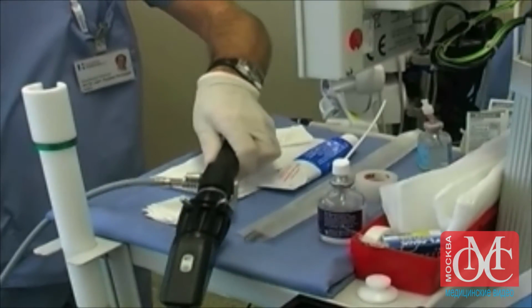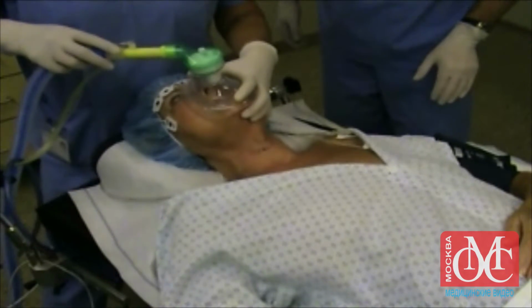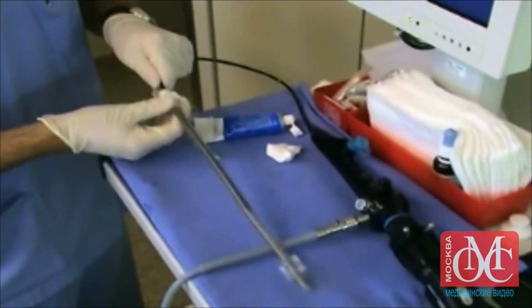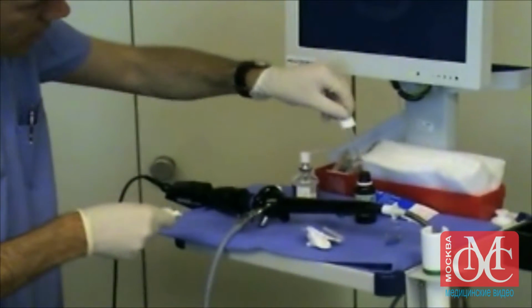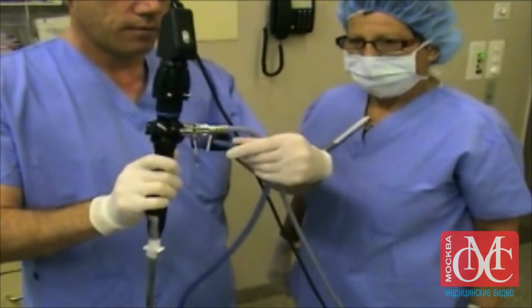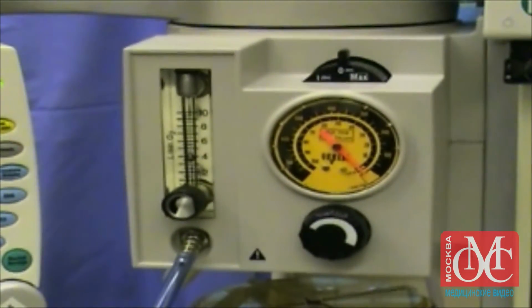While you are preparing the equipment, be sure to oxygenate the patient adequately with a firmly applied mask. Thread the tube over the lubricated fiberscope and fix it with tape or with the appropriate adapter to the fiberscope. Check to ensure that the fiberscope is flexible and provides a focused view, and then apply an anti-fogging agent to the tip of the scope. Connect oxygen to the fiberscope and provide 2 to 4 liters of oxygen per minute continuously.